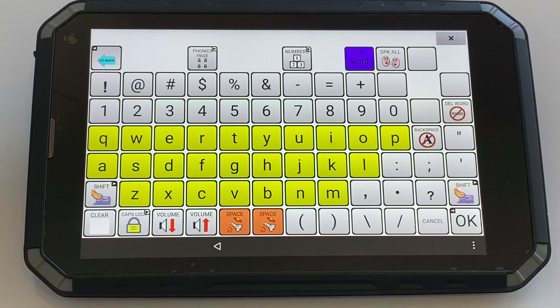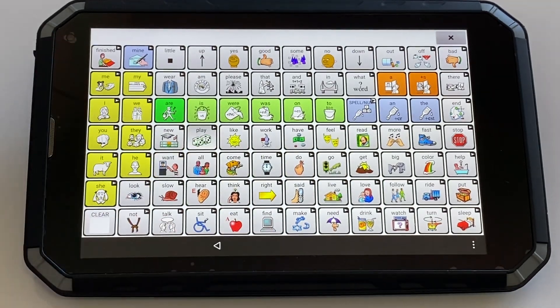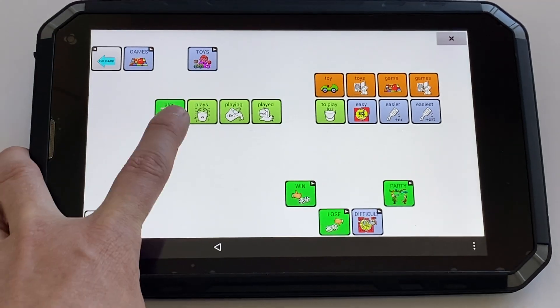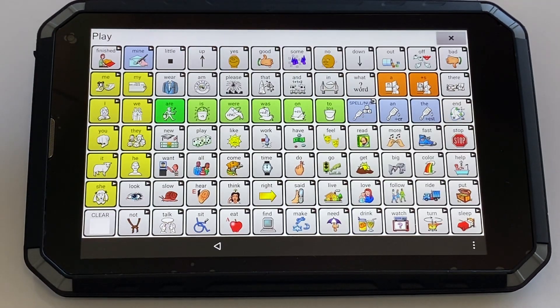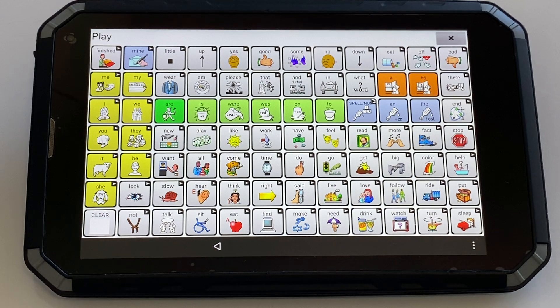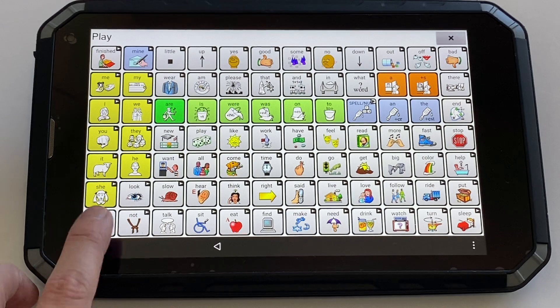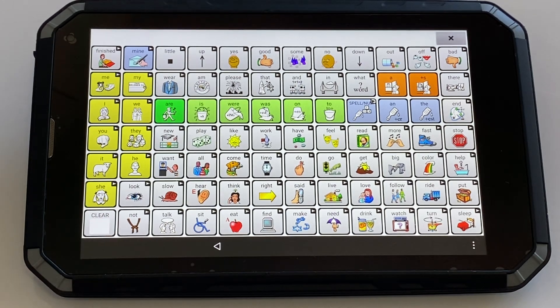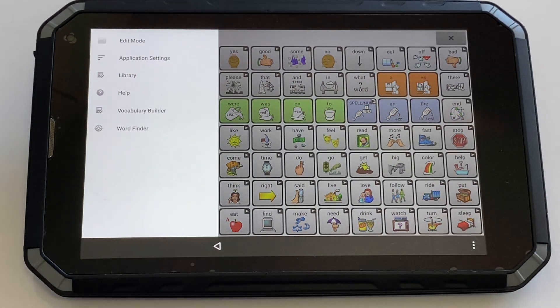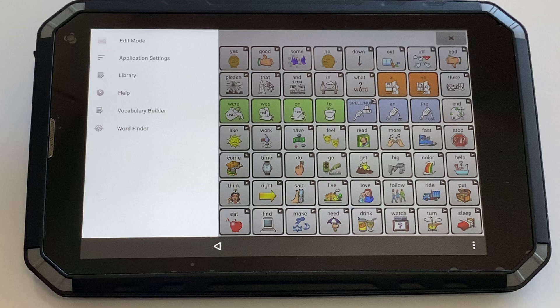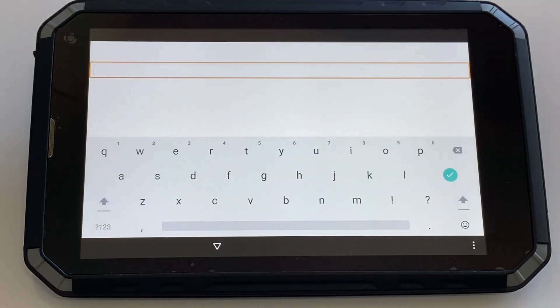You can then head back to play and follow that pathway. Alternatively, you can access the word finder in a different way: tap the three dots, select Word Finder, and type in the word you're looking for.